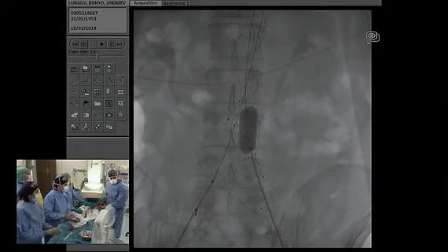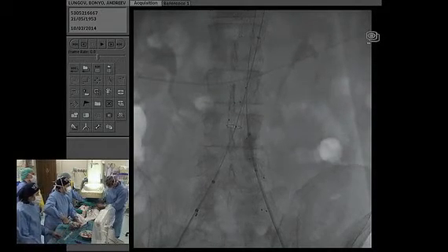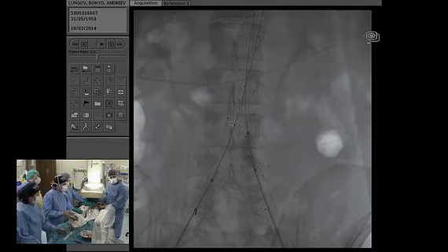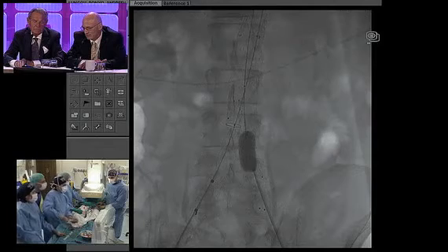Many times I look at this as though if this were an aneurysm I would treat independently, then I try to treat it. But a 2.2, 2.4 centimeter aneurysm, I normally wouldn't be treating those. So we'd try to leave that if we could with this type of technique or something like that.